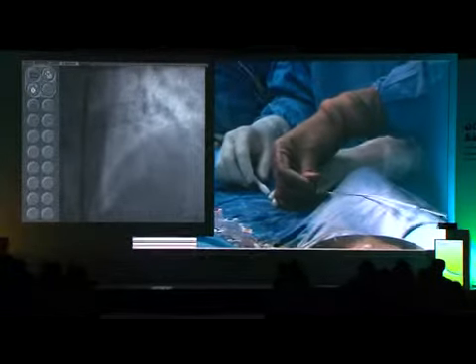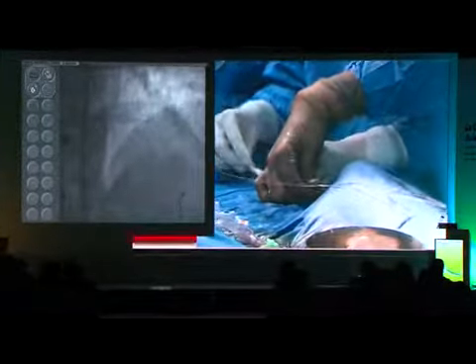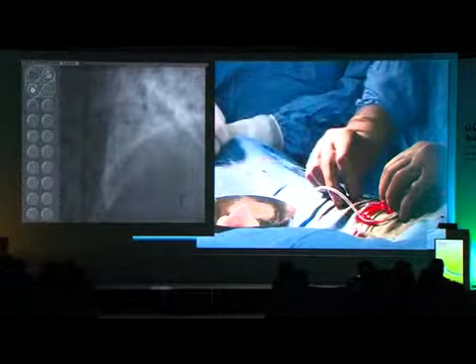So you have to use another stent. In any case, for these bifurcation stents, you have to use a second stent either in the side branch or in the main branch, depending on how you are using the bifurcation stent. So it's not just that one stent is enough. Take contrast, NTG.